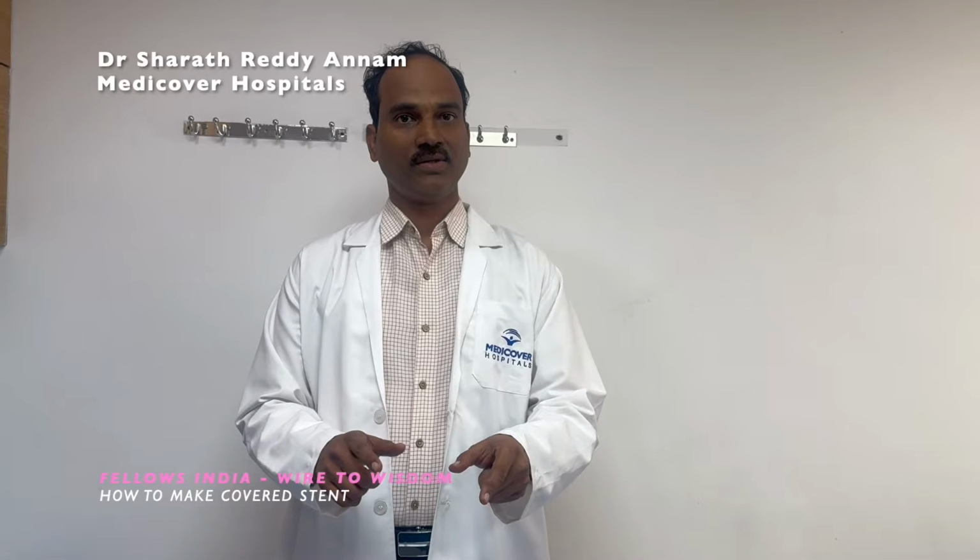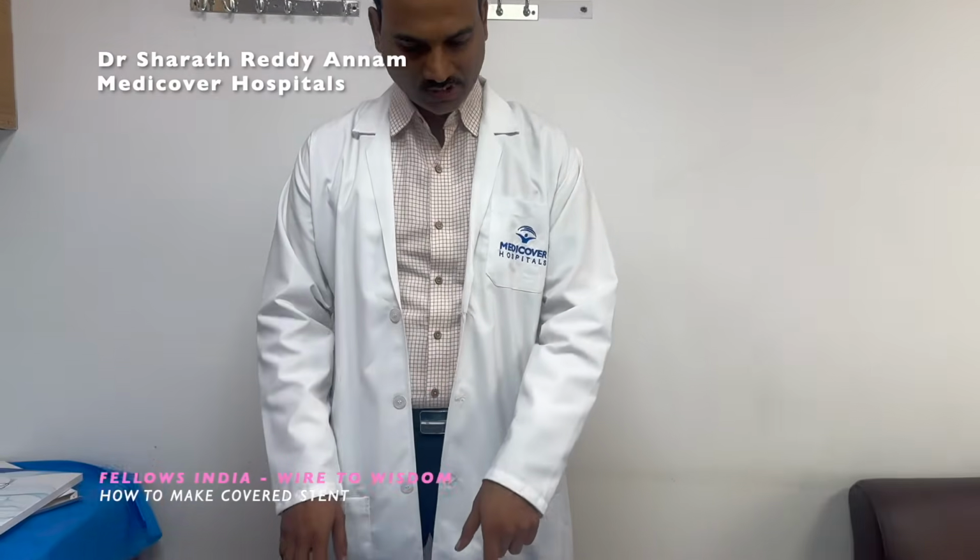In this session, we are demonstrating how to make a covered stent when a covered stent is not available in the cath lab. Now we'll show you the things you need to make a covered stent. You can see here.